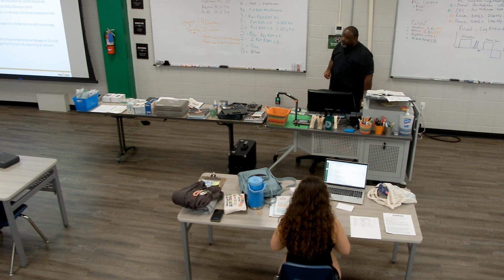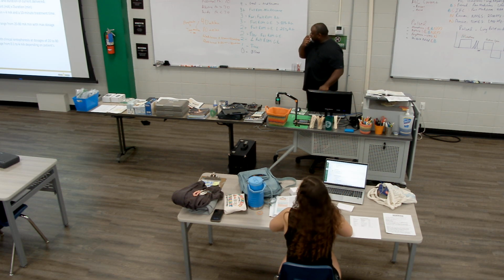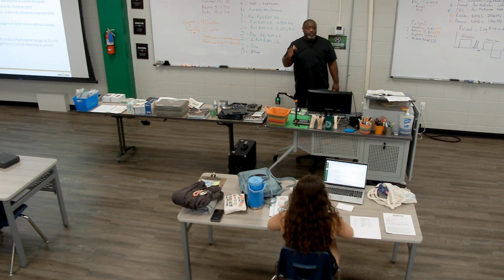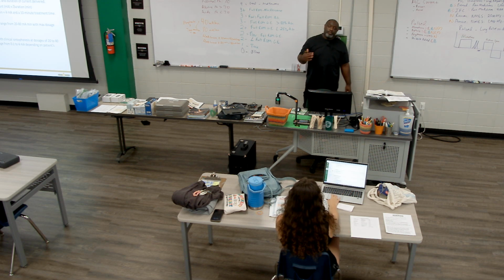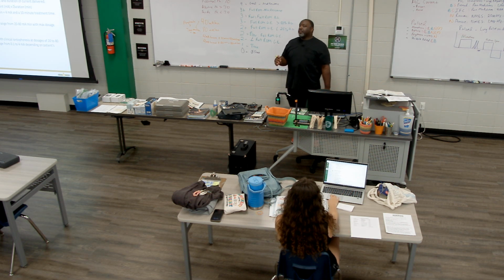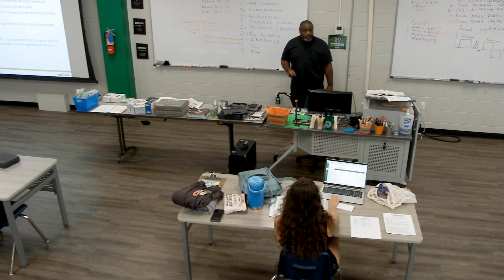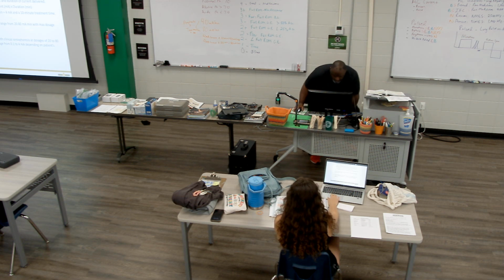Okay, so when we left, we were talking about iontophoresis and how its treatment is calculated. So again, it's not done like we normally would do. We don't talk about frequency, or pulse width, or amplitude. Well, we talk about amplitude. We don't talk about frequency, pulse width, on-off time, ramp, any of those things. We document iontophoresis in milliamp minutes of dosage. So you'll talk about which drug or medication you're iontophoresing, and then how many milliamp minutes of that you've actually done.